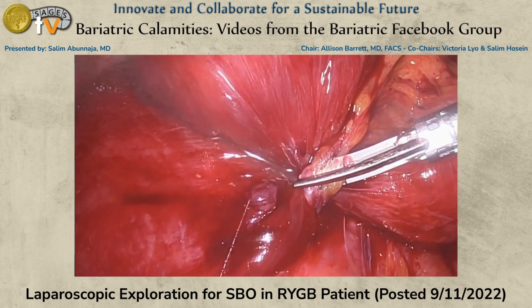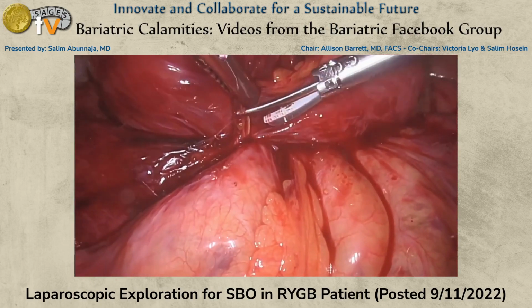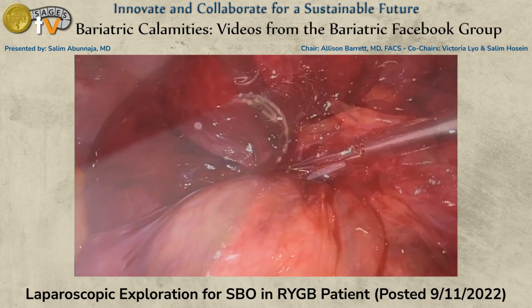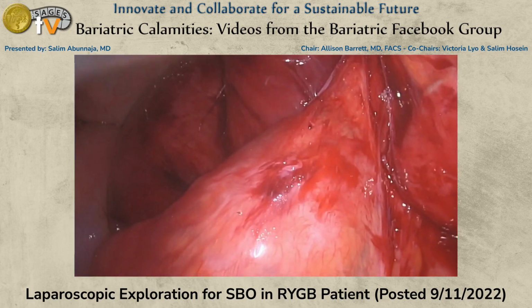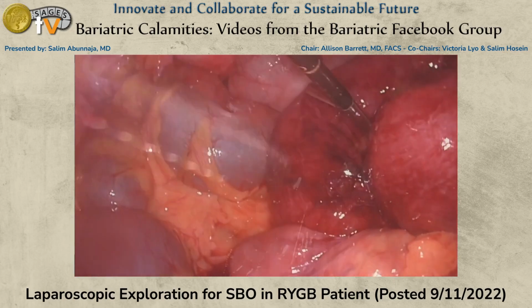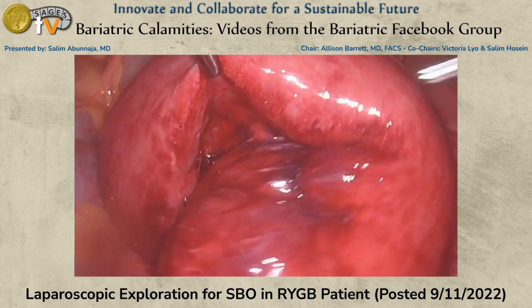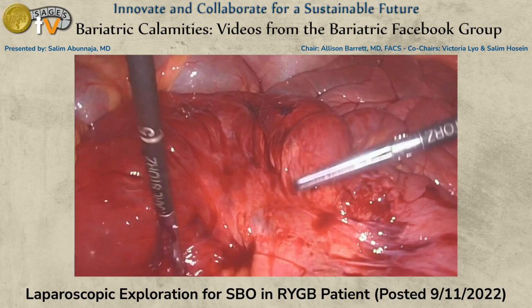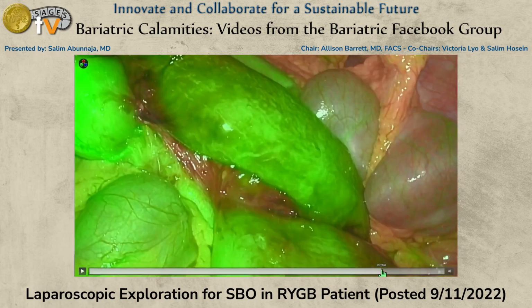You just divide that band, and the question remains after that, what to do with that loop of bowel. It looked very angry, but obviously did not look ischemic, and this is a laparoscopic case, so I would have just stopped there, not done anything more, and just observed the patient. However, we did use ICG. I thought that was a simple, easy thing to do, so we gave the patient a few cc's of ICG. You can already see the bowel starting to pink up a little bit and that congestion go away, but you can see clearly with the ICG that the bowel was viable.